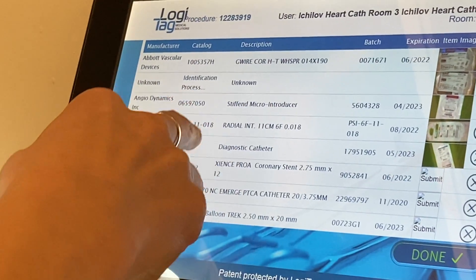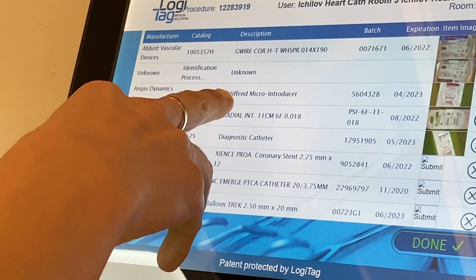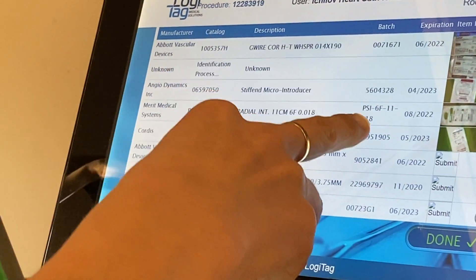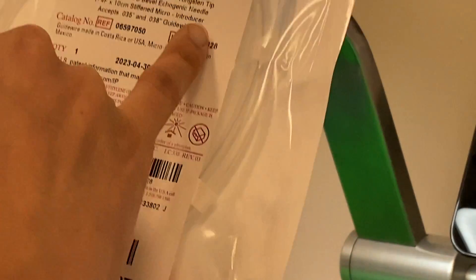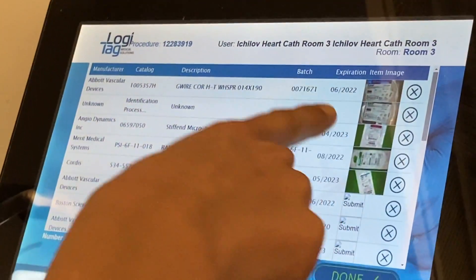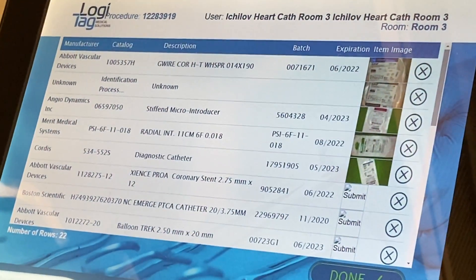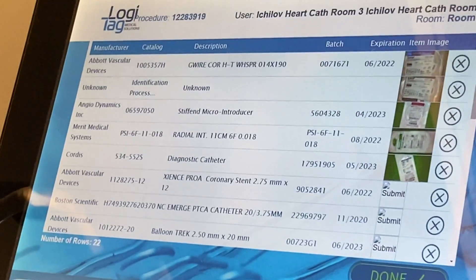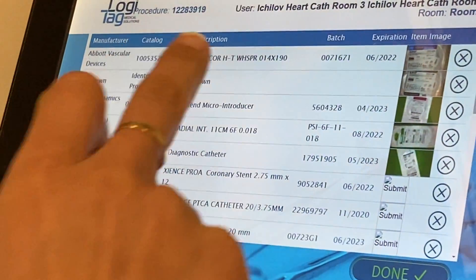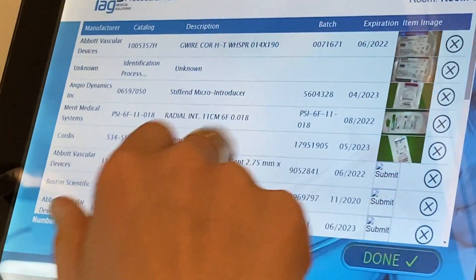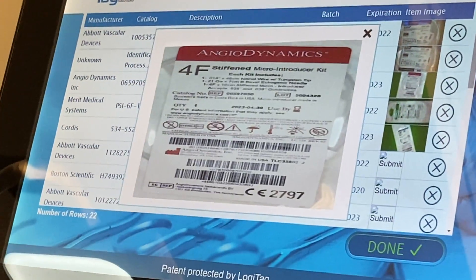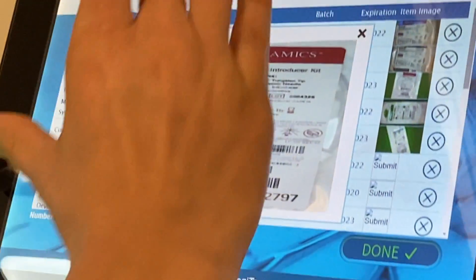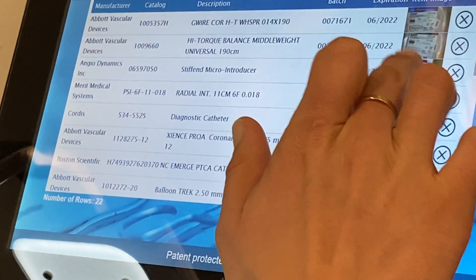The description and all this information is now saved in our database. The lot number was also read. And here the expiration date: 4th of 2023 — and over here also 4th of 2023. I can go in here and see all the details; it's a bit compressed on screen but it's more for back-office purposes.